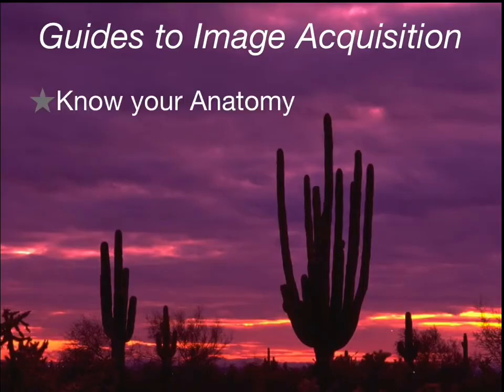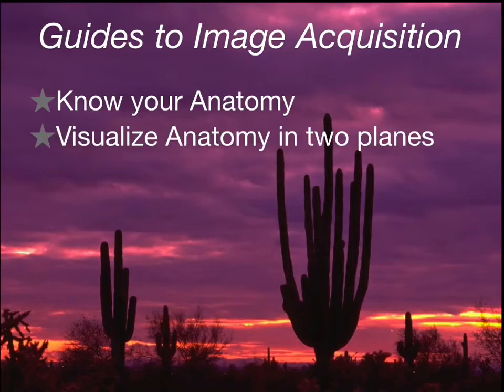So to summarize here, you've got to know your anatomy. You've got to know what structures lie next to other structures. Ultrasound has 3 orthogonal planes, if you will, like everything else. It's got the sagittal, transverse, and coronal planes, but you know what? You end up visualizing all of this anatomy in at least 2 of these planes. In fact, I would say ultrasound is infinity planes, because as you fan that transducer through these organs, in your mind's eye, you're recreating them.